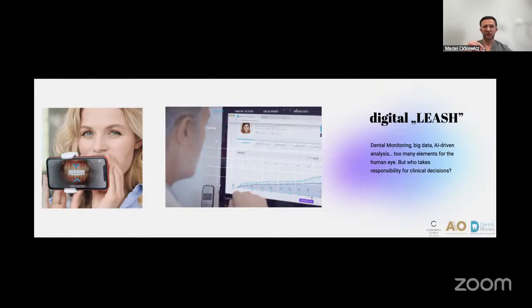The patients have to check by themselves whether the aligners are fitting very well, because who is responsible for that? If you bring in dental monitoring or other elements, or AI, or somebody delegated by you, the responsibility will be on this person.